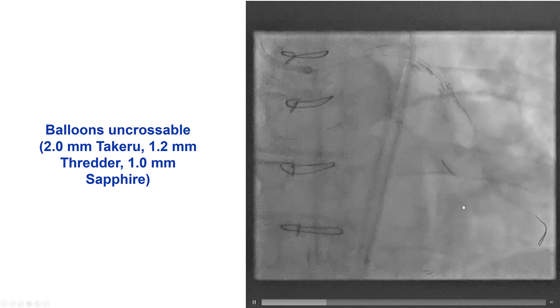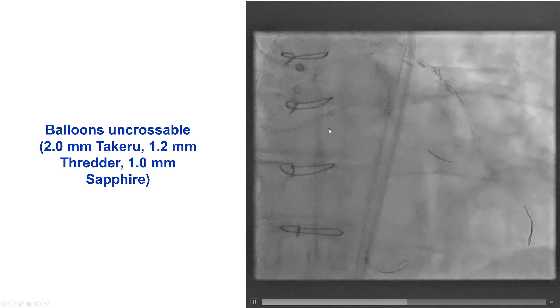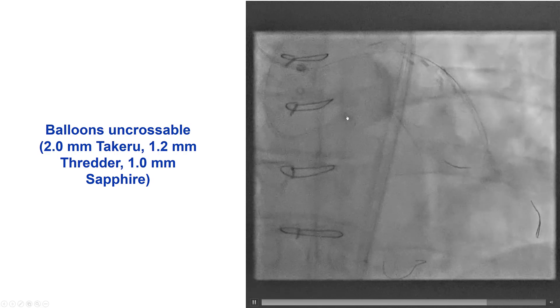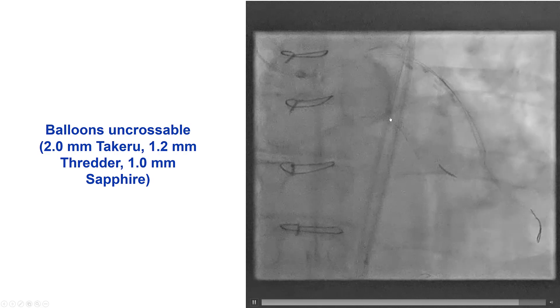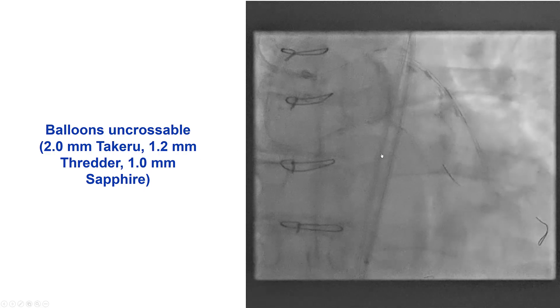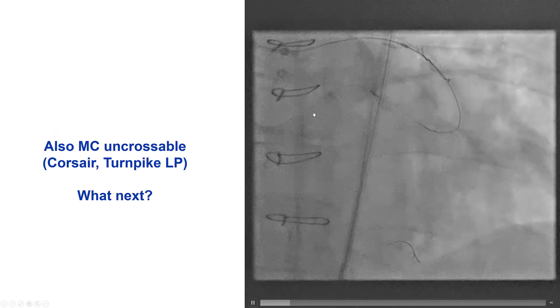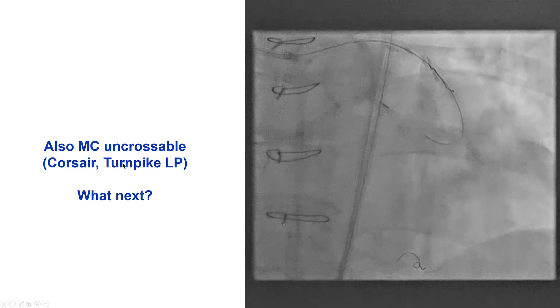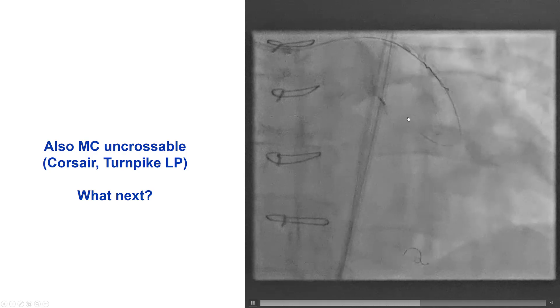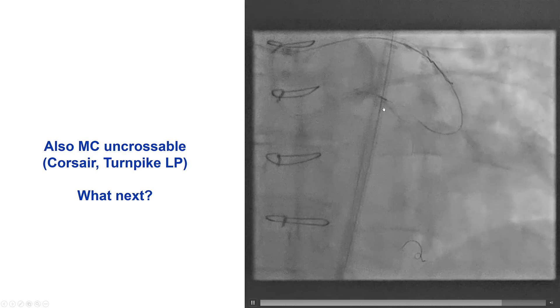At this point we thought the challenging part was over and now it would just be balloon and stenting. However, we faced the exact same problem antegrade — we could not advance even small balloons through the proximal cap. We tried a 1.0 Sapphire, a Threader, a 2.0 mm Takeru, and nothing would go through. We also tried antegrade microcatheters — a Corsair as well as a Turnpike LP — but once again nothing would go through. There is significant calcification and also possibly some interaction with the previously placed circumflex stent.